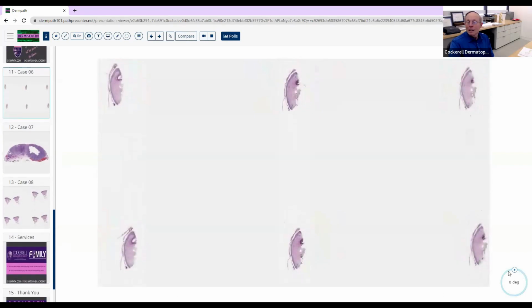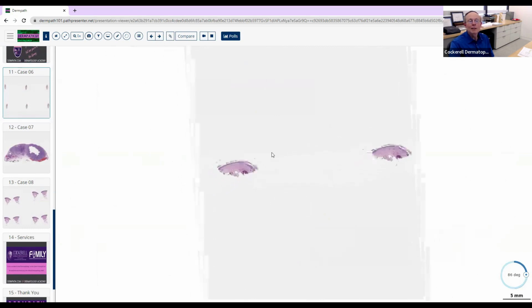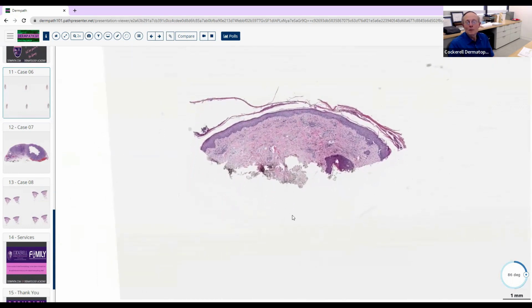Okay. All right, I got another one here for you guys. This is kind of sneaky, but they probably won't do this to you on the board, but still, we'll put it in here for you. You'll be ahead of your colleagues. Good morning, Dr. Cockerell. My name's Yelena. I'll take this case. Looks like we have a shave going on, and I was favoring an inflammatory process for this one.